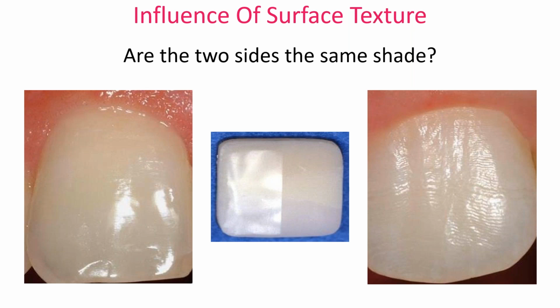We need to understand, is it textured, is it not textured? It could be the exact same shade, the left picture, the right picture, but because of the texture, it's going to break up the light and look different than a flat, smooth surface that looks more opaque and has more reflection, right? Opaque makes it look brighter. But visually, our eyes can't distinguish chroma from value. It's difficult when you incorporate visually the light and the different texture, but we have to mimic the texture if we're going to get the target of the shade correct.